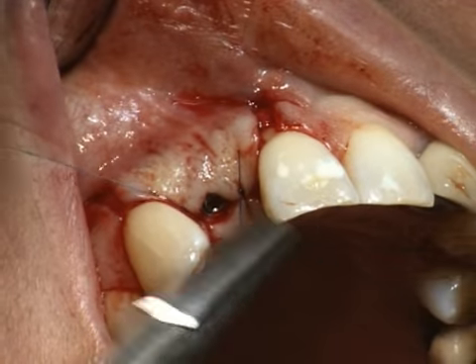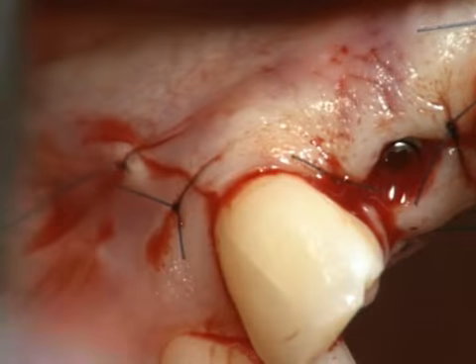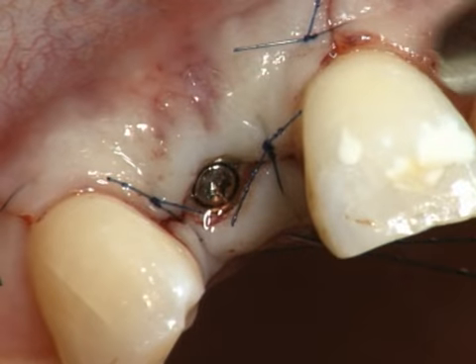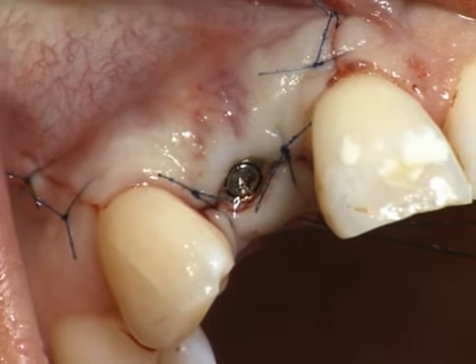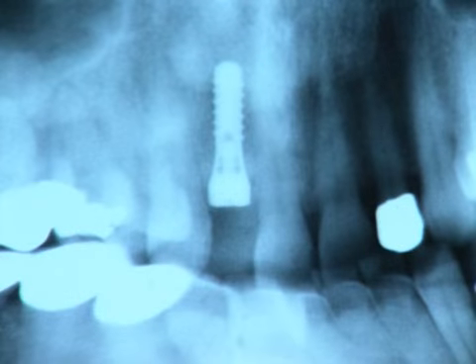This is followed by closure of the vertical relieving incisions. The sutures are removed after about 7 days. The post-operative X-ray shows the correctly placed Straumann StandardPlus implant with the implant axis in good parallel alignment with the adjacent teeth.